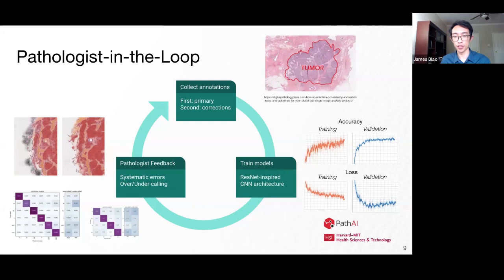They scroll through the thumbnails, and then they look for things that stand out to them, and then maybe they'll zoom in and take a very close look at like 5 slides or something like that. Okay. Yeah, so they don't look at 1,000 slides and aggregate all the information in their minds. It's usually just a sampling, because usually the errors that are made on one slide will typically be reproduced in the other slides.